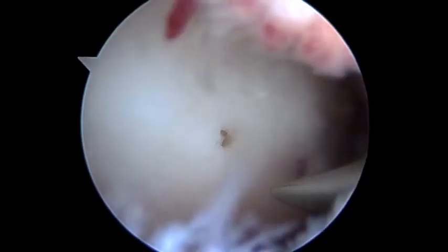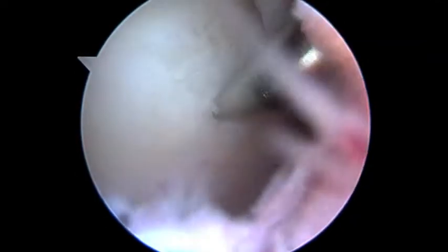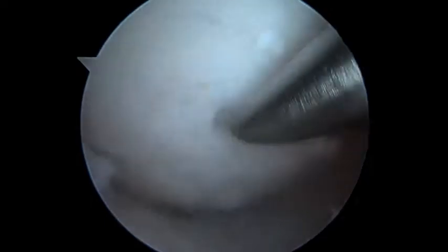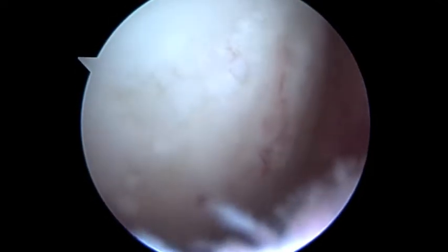You can see we're using this instrument to make some holes in the bone. This is what we talked about in the office. You can see how the marrow comes out — that's where we get some stem cells. And then of course we're about to inject what we made. So we'll go ahead and take out the punch.